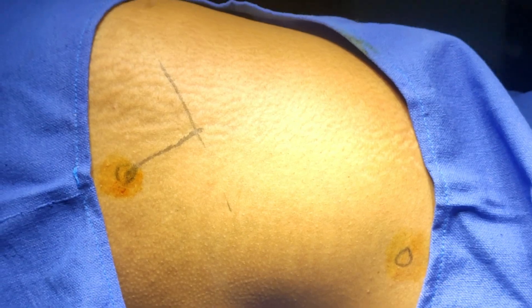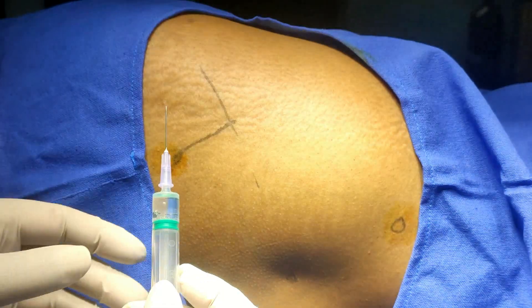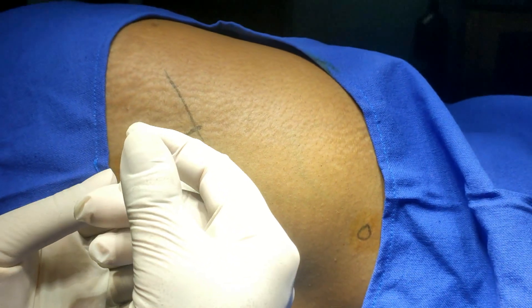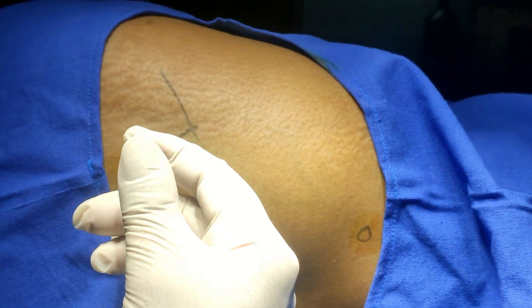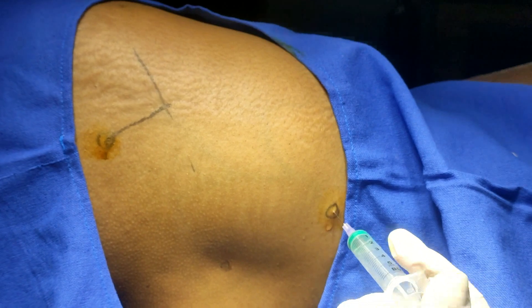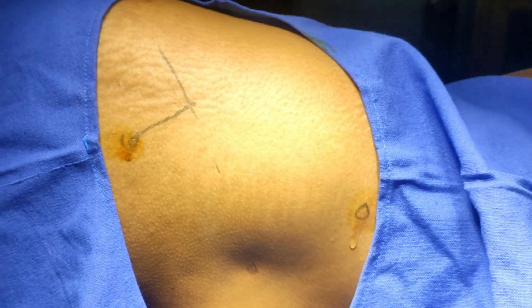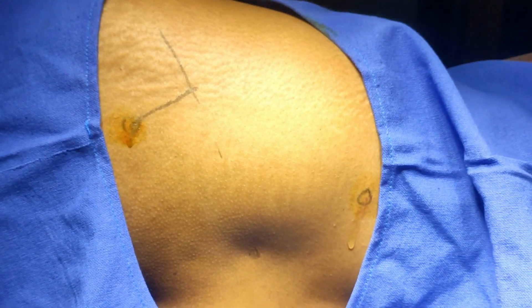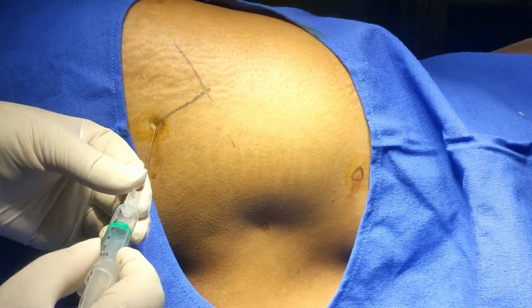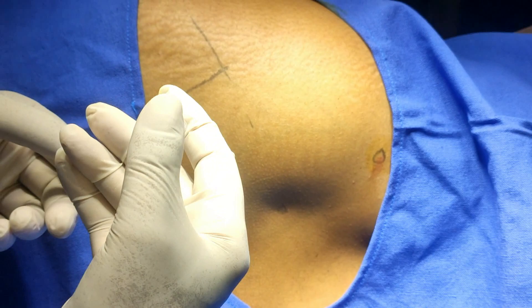Just infiltrate a little bit in this area. Inject a little amount of the solution here, and inject a little amount of the solution. This is already anesthetized, so there should not be any pain — just insert the needle perpendicularly in all directions.